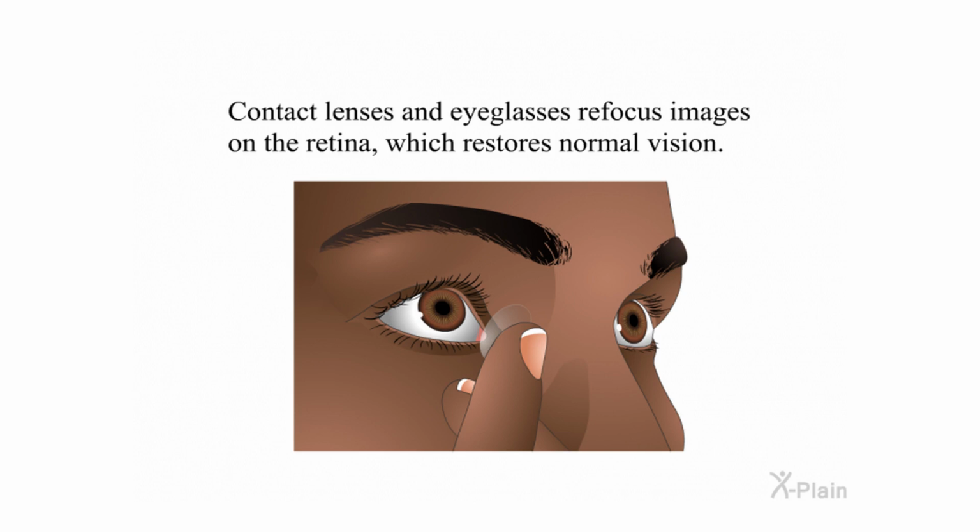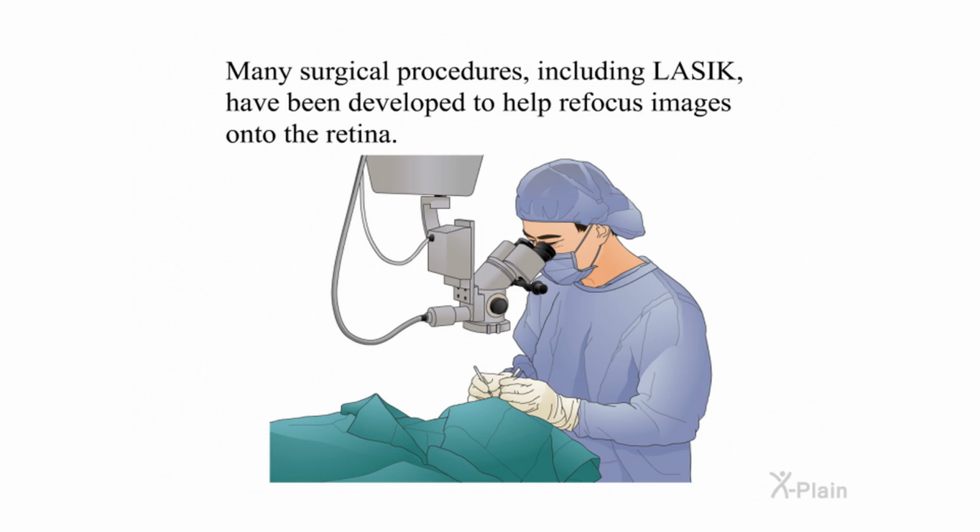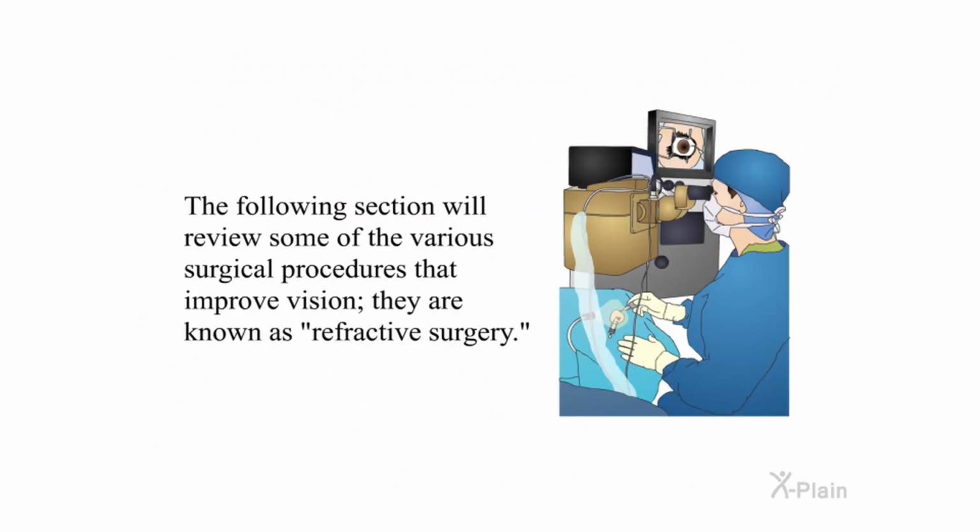Contact lenses and eyeglasses refocus images on the retina, which restores normal vision. Many surgical procedures, including Lasik, have been developed to help refocus images onto the retina. The following section will review some of the various surgical procedures that improve vision. They are known as refractive surgery.